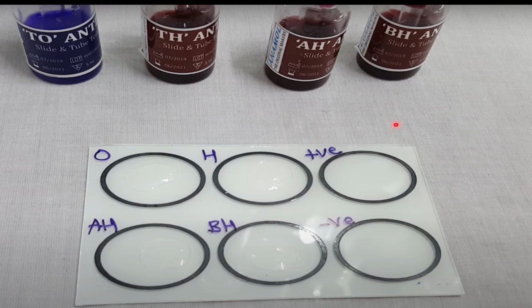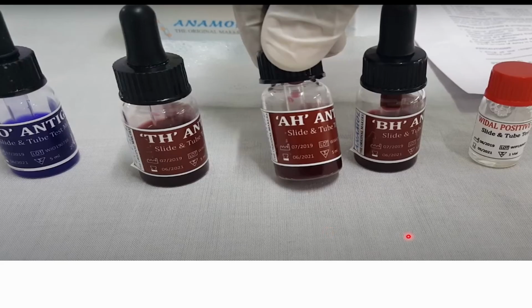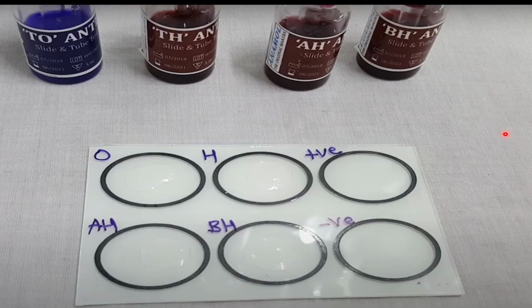And after you put all this, we have 2 more places. Here you put the positive control, that white bottle one, and the negative control you will put here. And take this O antigen and put it here and here. So after this, what will you do? After this, just chill out, go to your home, sleep, and then come back. No, you are in the hospital.